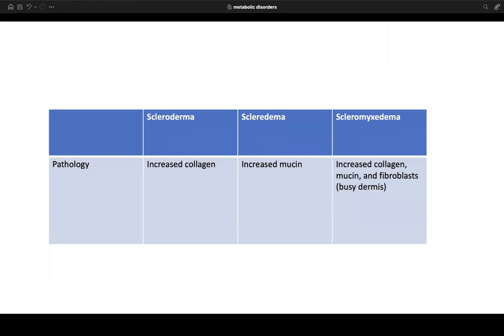Key histologic distinctions: scleroderma shows increased collagen; scleredema shows increased mucin in the dermis; and scleromyxedema shows increased collagen, increased mucin, and increased cellularity composed of increased fibroblasts — so-called fibroplasia.